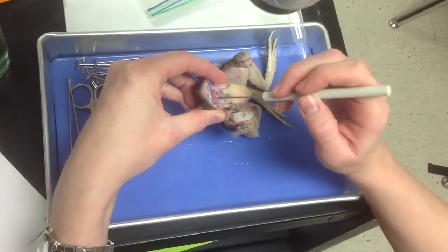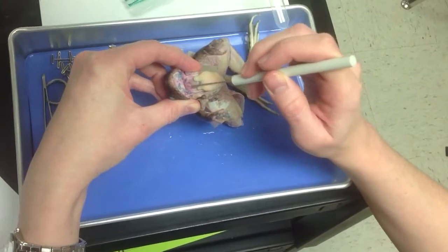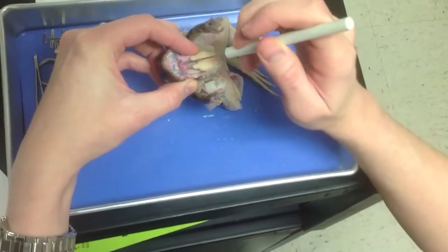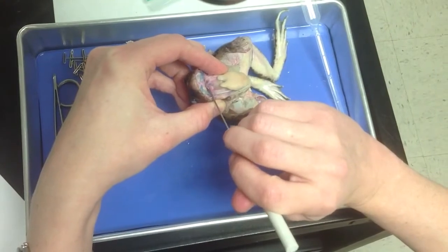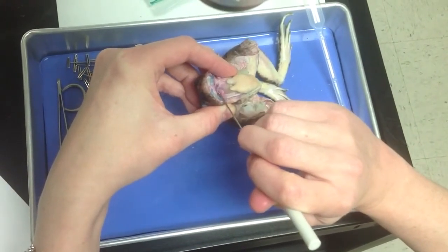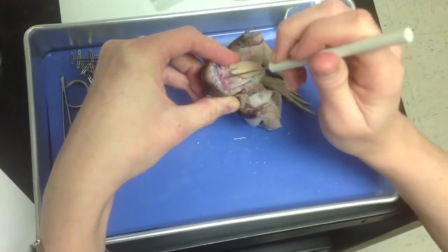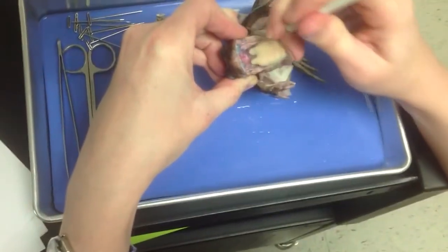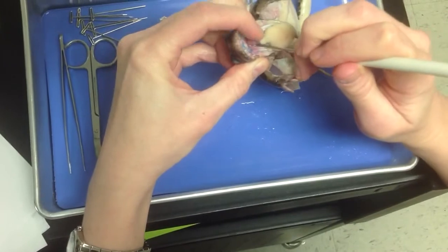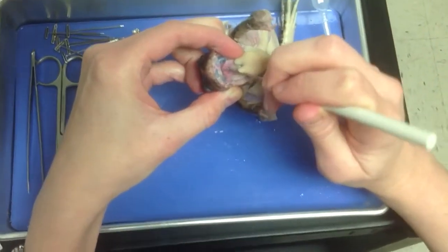You're going to want to find the entrance of the trachea. Take your probe — watch me — and you're going to kind of slide it across. When you slide it across the hole, it should kind of come open. Do you see how mine can come open just right there?